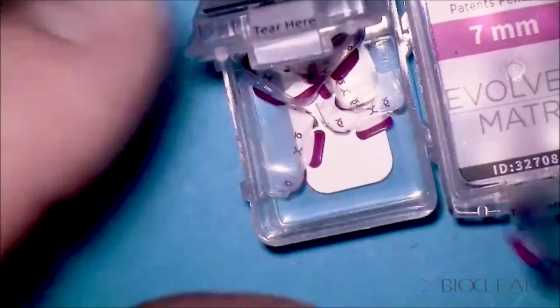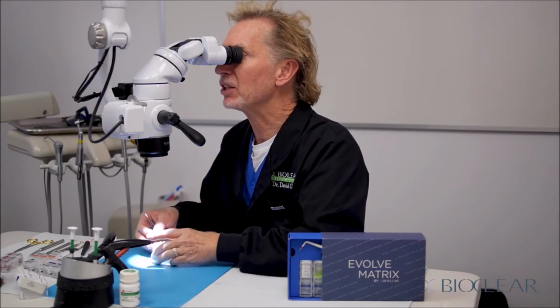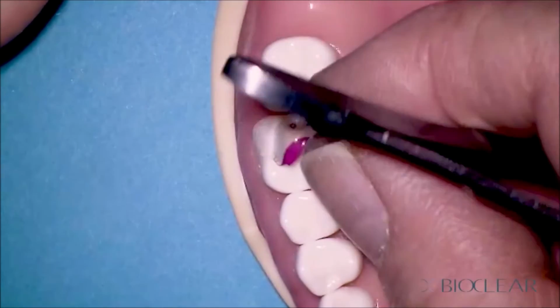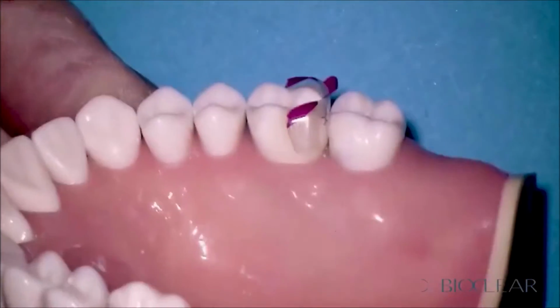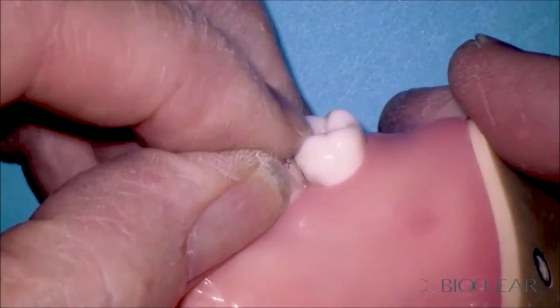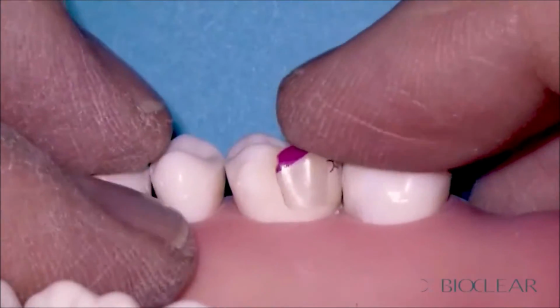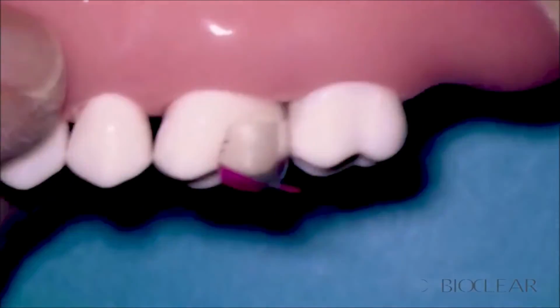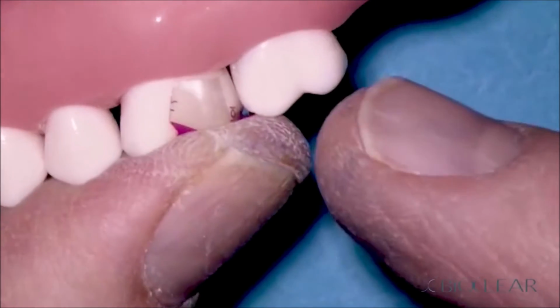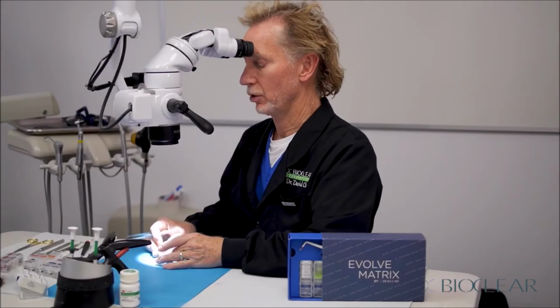And so you have certain patients in your patient pool that have huge molars. And you also have patients that have root proximity or rotated teeth where you just don't want that much curvature. Now take a look at the pink. That, in this case, would be the best matrix of all. Now, I don't use these that often, but when you see a wide tooth like this, and it's flat, and you've got root proximity that you can see on the radiograph, that is a really ideal matrix for that situation. So those are our three choices. There's a matrix type indicator. Have fun.